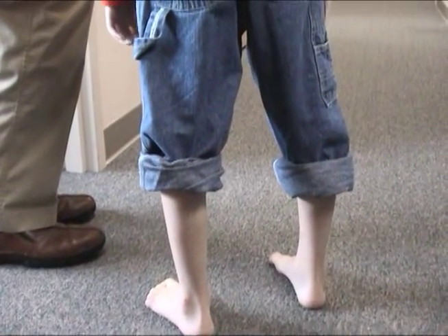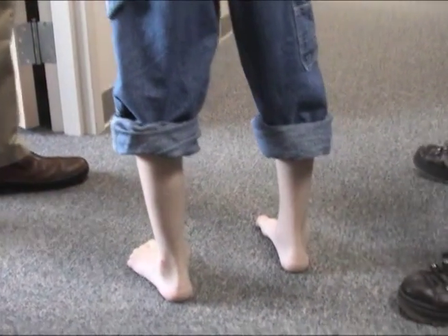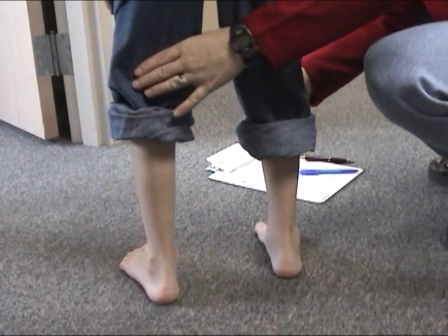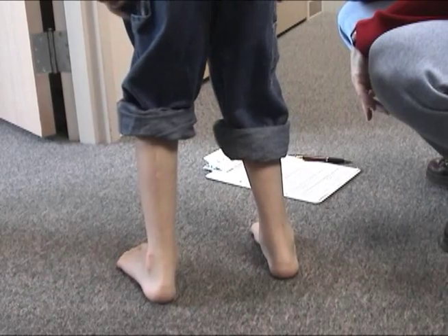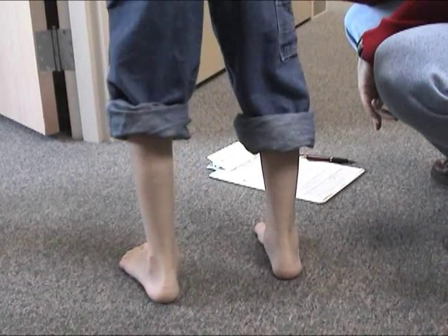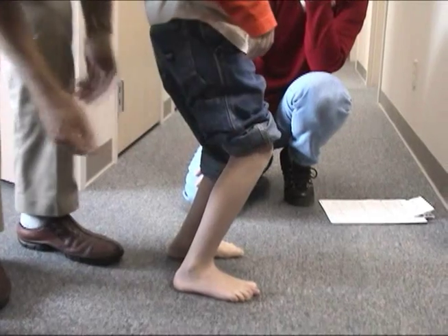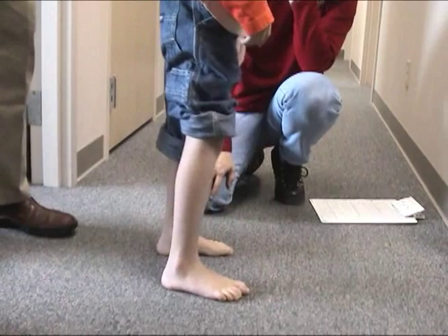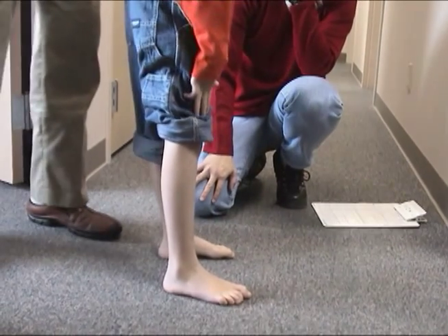The plantar flexion position that we see at mid stance does not seem to be driven by high tone. However, if you watch his ankle closely, there is a slight deviation in consistency in his ankle control. My sense is that it isn't as dependable as we would like.